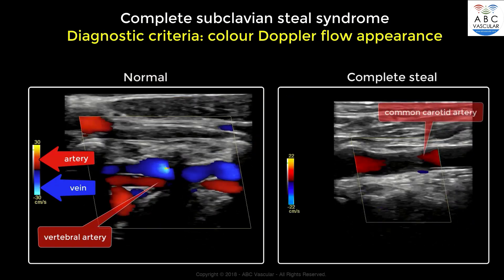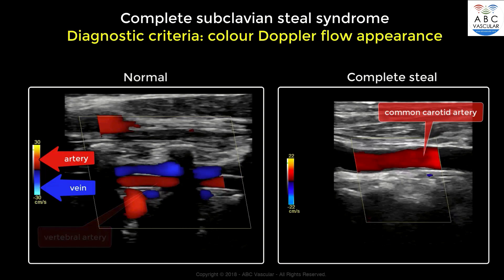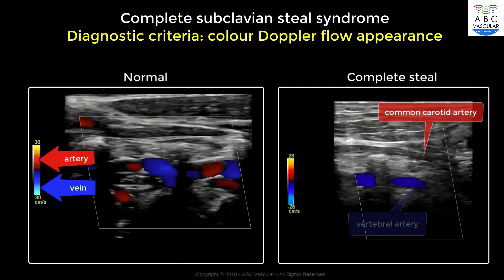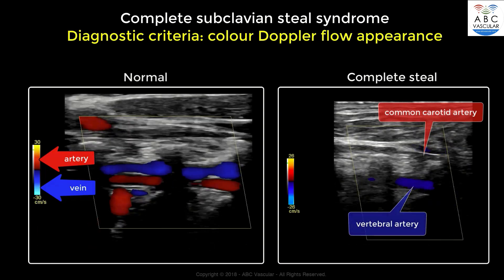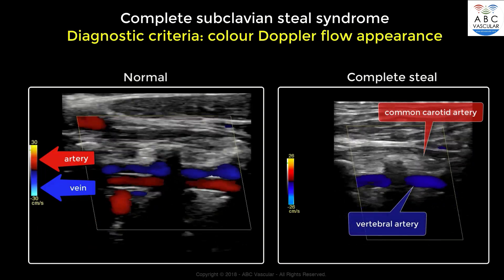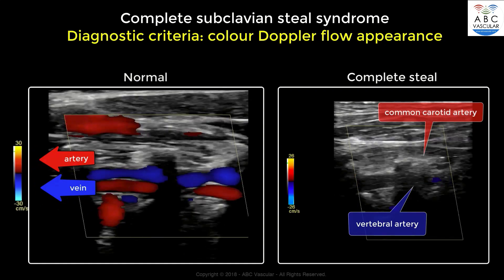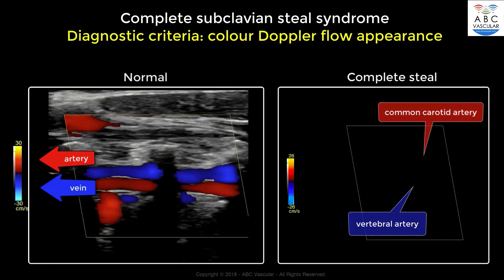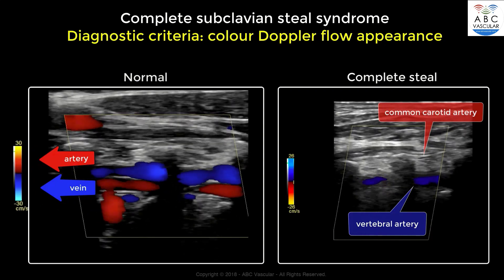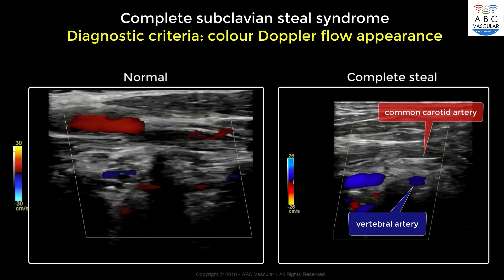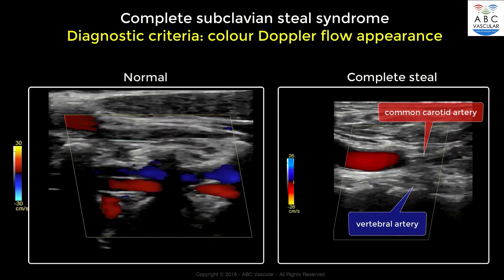In the presence of a complete steal, while the common carotid artery will appear in red, the vertebral artery will appear in blue, thereby indicating the different direction of the flow through the vertebral artery compared to the ipsilateral common carotid artery.